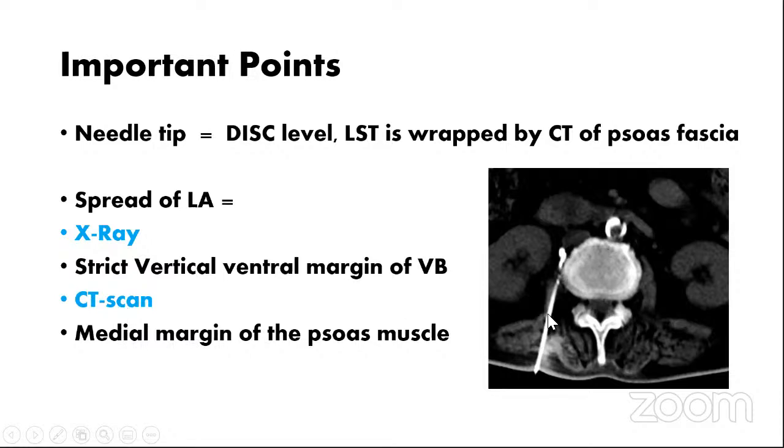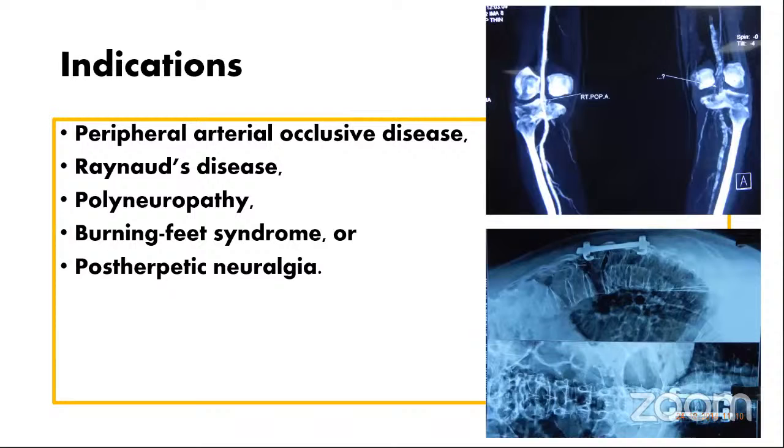So this is the needle which I place under the CT scan. The needle has to be still further here at this point, and then you can inject your local anesthetic along with the steroids.